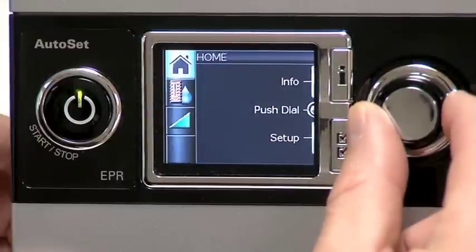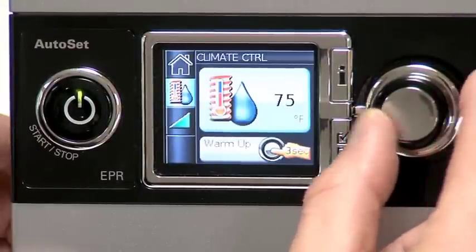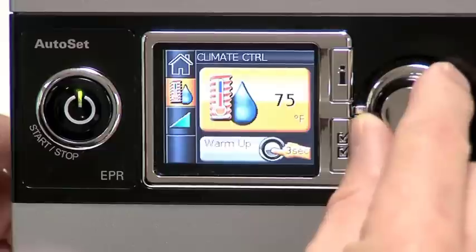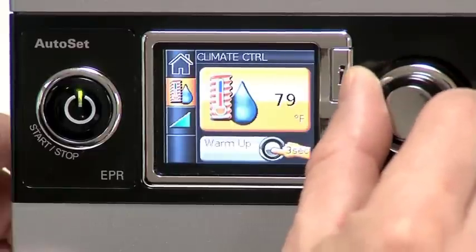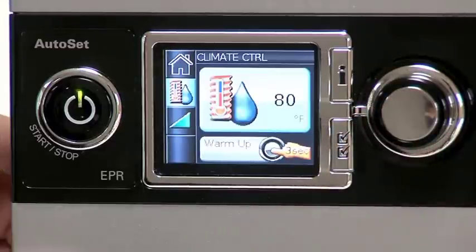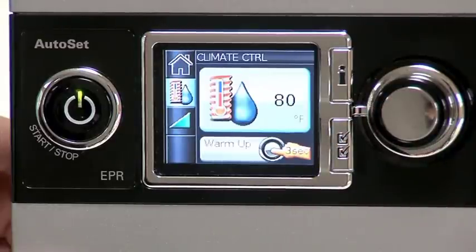If your medical equipment provider has given you a climate line tube, adjust your climate control settings in a similar fashion. Start with your home screen and adjust until you see climate control settings. Then choose your setting anywhere between 60 and 85 degrees Fahrenheit. It's recommended that you start with a setting of 80 degrees and adjust up or down based upon your comfort level.